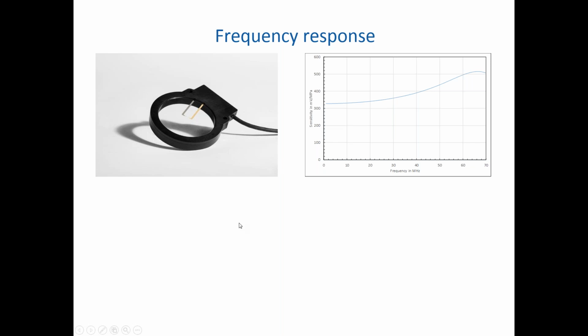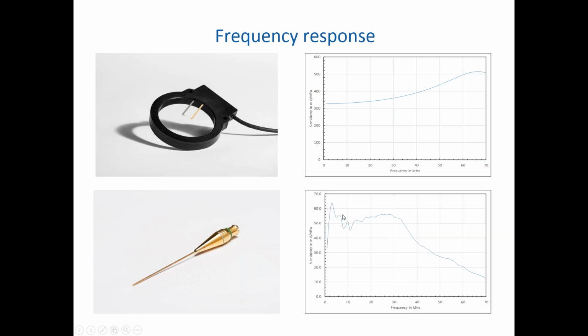In contrast, if we look at one of the devices, a needle hydrophone, that we said has a diffraction limited aspect to its frequency response, we can see here that this particular hydrophone has quite a noticeable peak here and quite a noticeable trough here, and then a flatter region in the middle before eventually we start to tail off beyond about 32, 34 megahertz. We're starting to see a decrease in sensitivity. Again, for this particular model, different hydrophones have a different response.